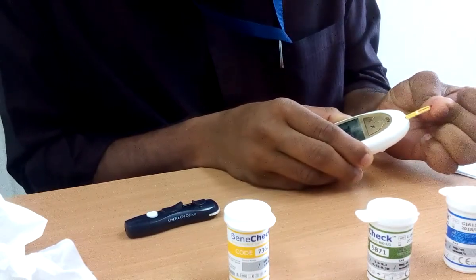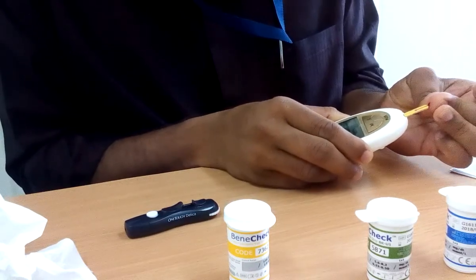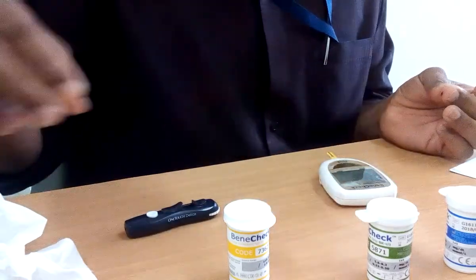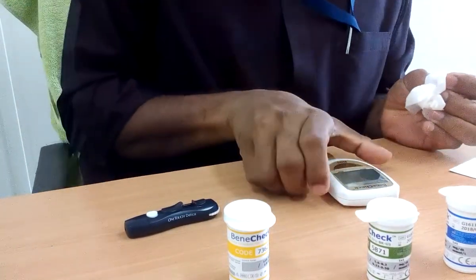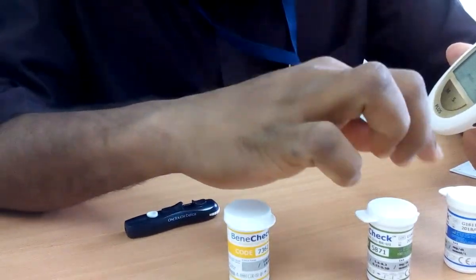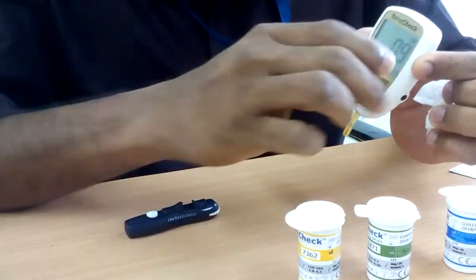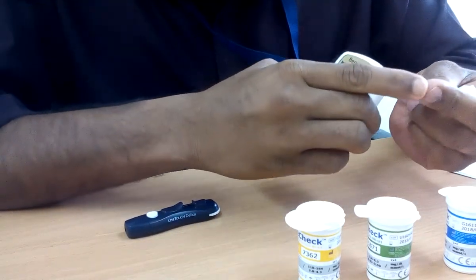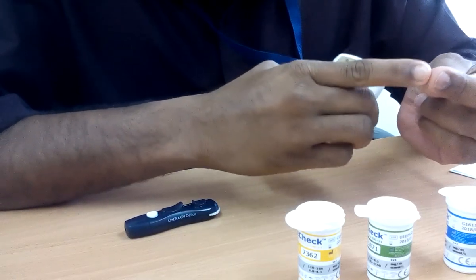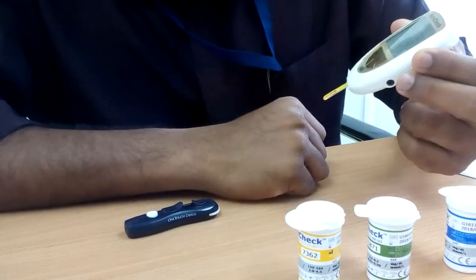The strip absorbs the blood very nicely; it needs a bit more. Now I have already finished glucose and uric acid and am waiting for the cholesterol result. The total cholesterol result is 173.